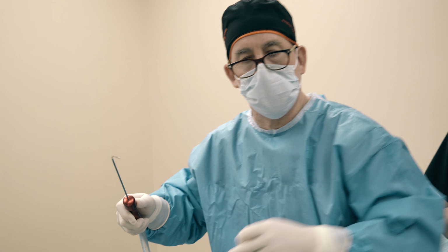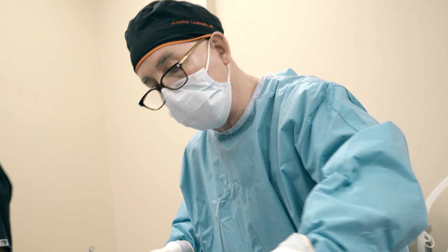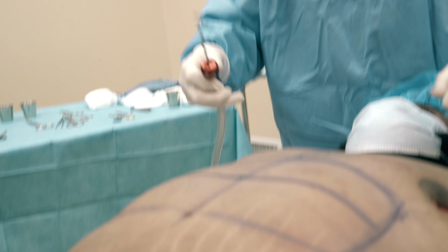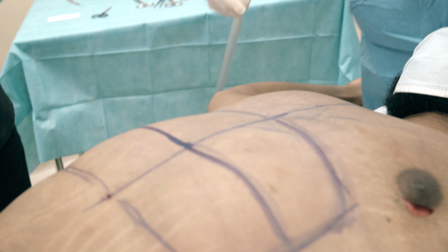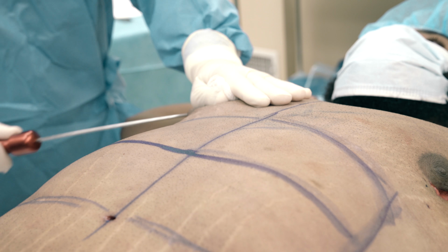So I took out his glands, I lipoed him, and now, you know, this is part of what I do. So I'm etching his, I've already etched the bottom and the top, but I'm gonna go over that again. This is my curved cannula.